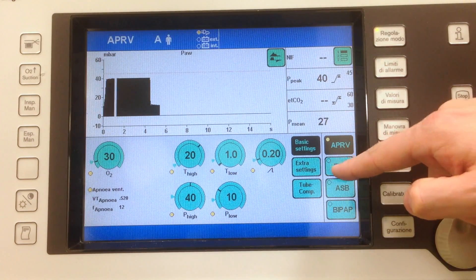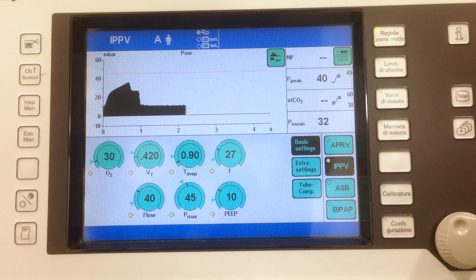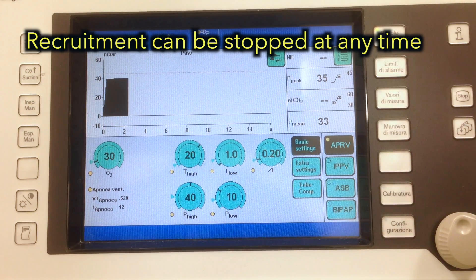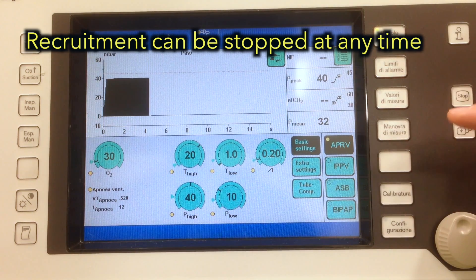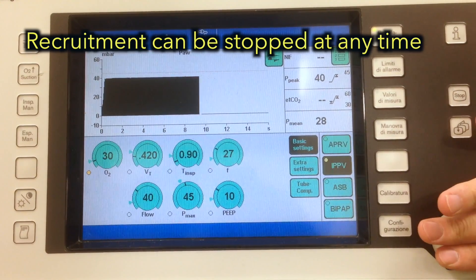Once this is finished, just switch back to your previous ventilatory mode. The recruitment maneuver can be interrupted at any time simply by switching back to your previous ventilatory mode.